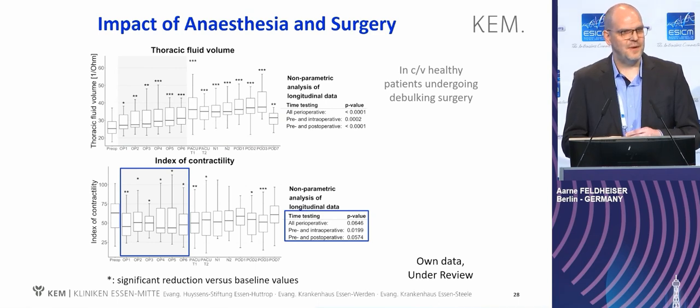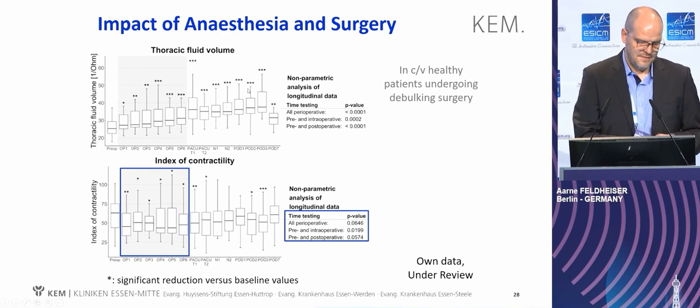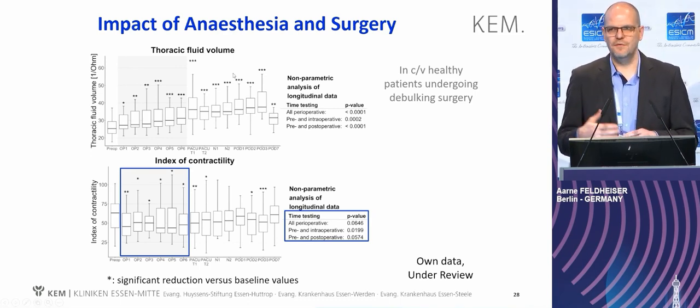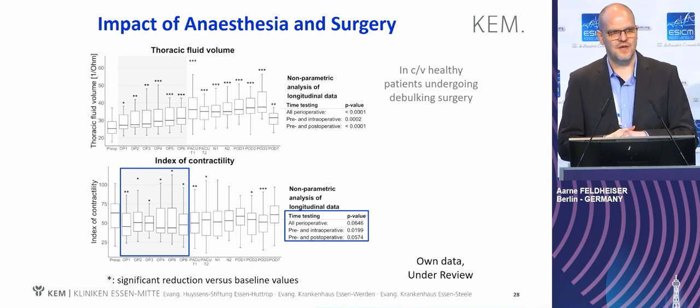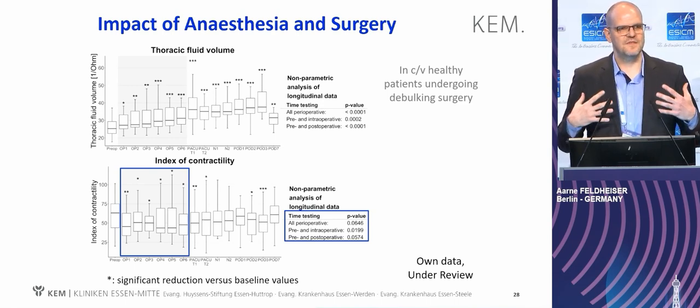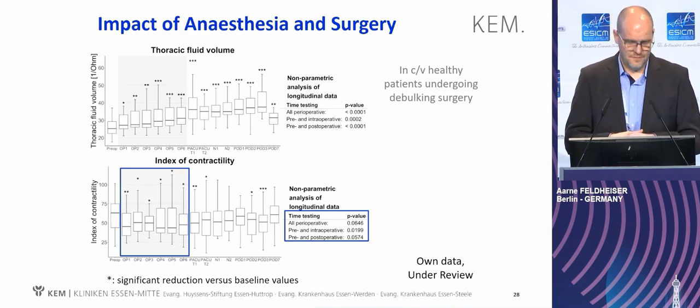But this was based on our fluid administration, mirrored by this graph, where we could show that already with the first measurements, we have an increase of thoracic fluid content, as a fluid measurement in the tissue of the thorax, and this was maintained up to the third postoperative day.